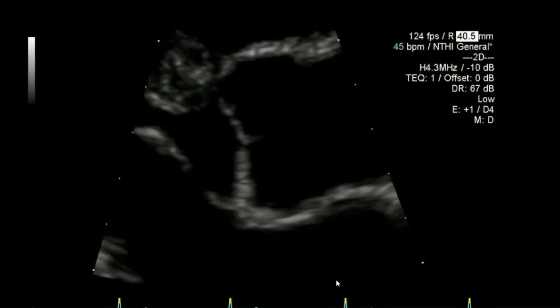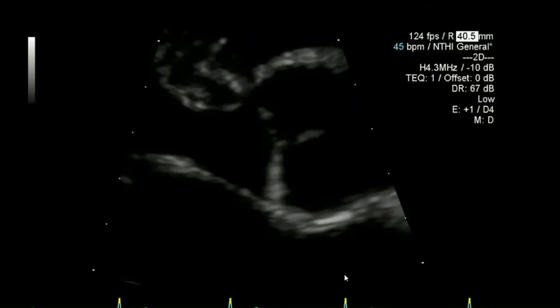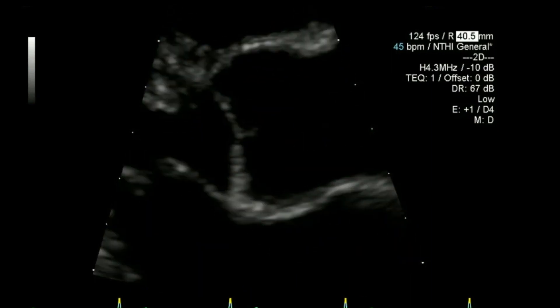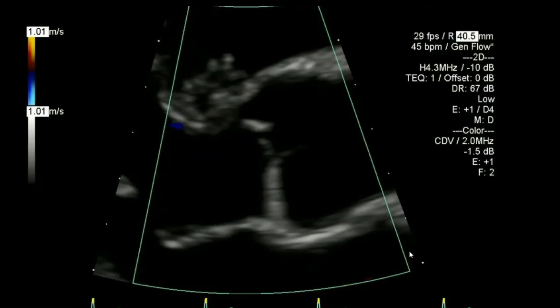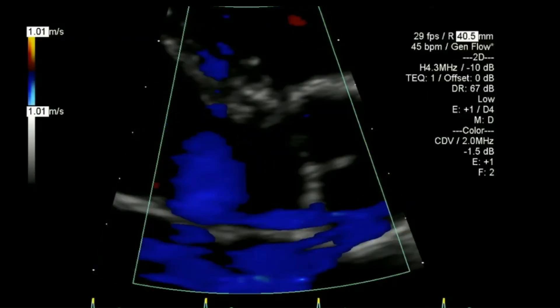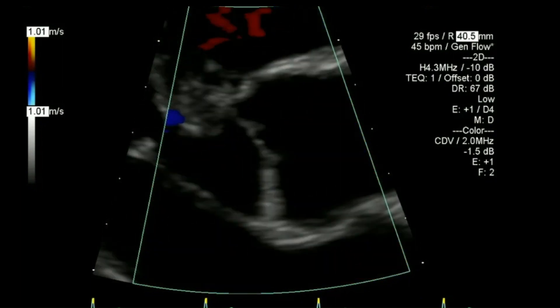From here I'll zoom up on the aortic valve and aortic root, measure the aortic root in that view leading edge to leading edge, and then similarly do a colour flow of that same view.